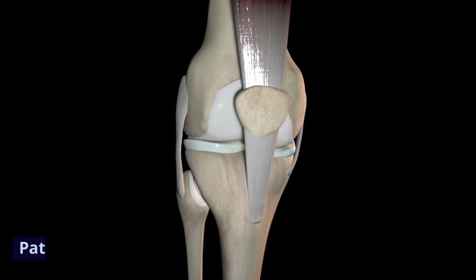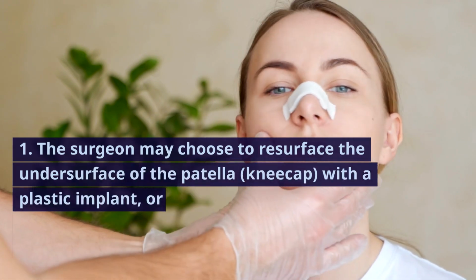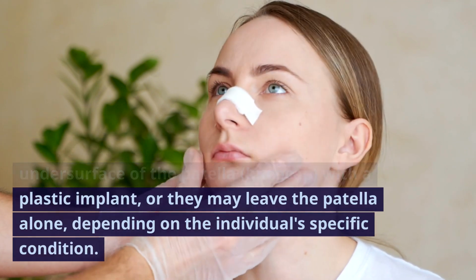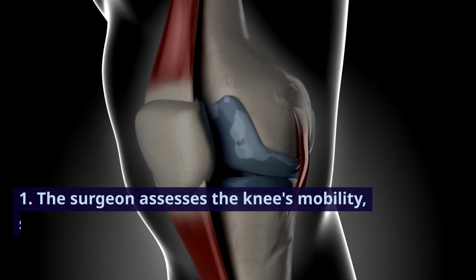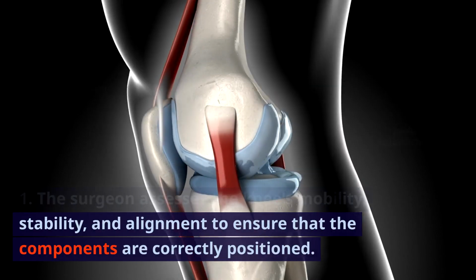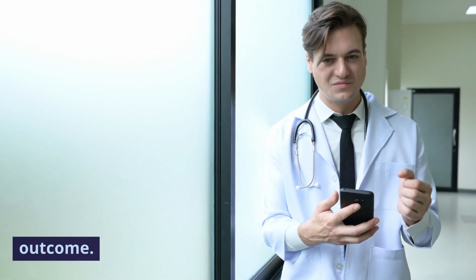Patella resurfacing, optional. The surgeon may choose to resurface the undersurface of the patella (kneecap) with a plastic implant, or they may leave the patella alone, depending on the individual's specific condition. Testing mobility and alignment. The surgeon assesses the knee's mobility, stability, and alignment to ensure that the components are correctly positioned. This is crucial for a successful and long-lasting outcome.